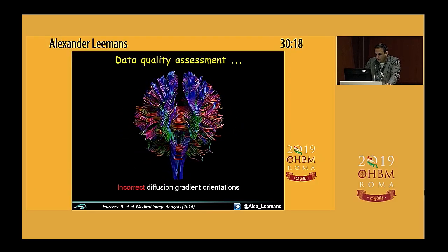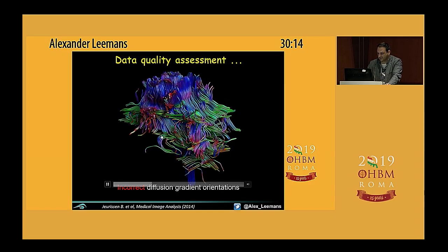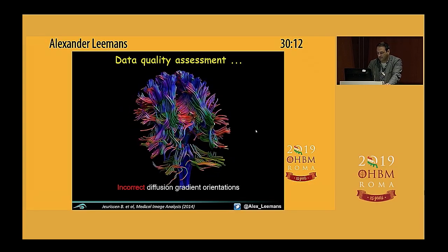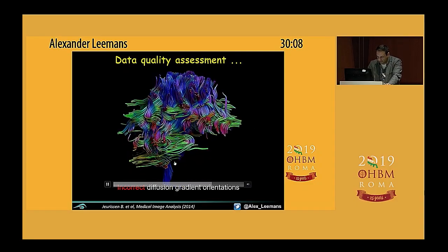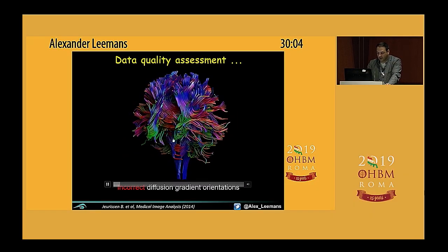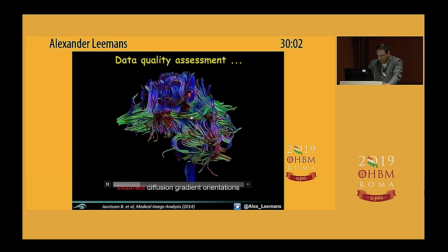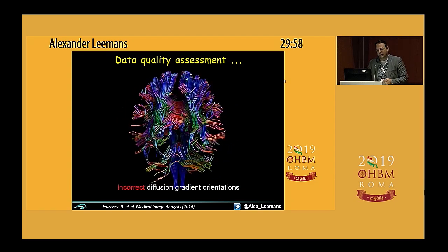Look here, the uncinate fasciculus. It's reversed. Look at this. And even the corticospinal tract, it's cut. Like the patient should not move anymore. But look at this. It's still moving. And another one which is convenient, like, hey, can he actually speak? No speech network here. Like, where's the arcuate fasciculus? So indeed, you think like, wow.